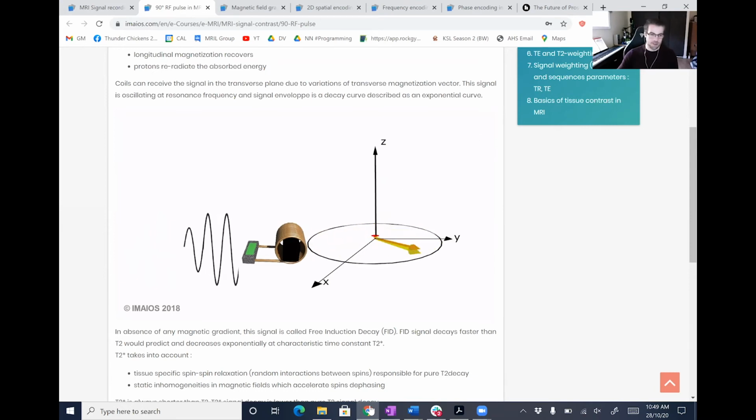It gets smaller much more quickly. Kind of talking in simple terms, but hopefully it's useful. Now I'm just going to make one more note on this animation that, again, with that point of reference that's recording a precessing magnetic field, that's the signal that we're getting on the left there. That's called free induction decay, and we'll touch on that after our transverse magnetization at the end.